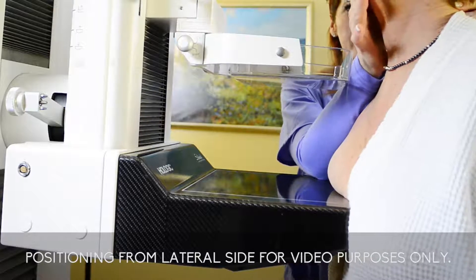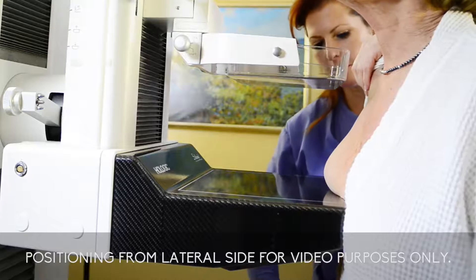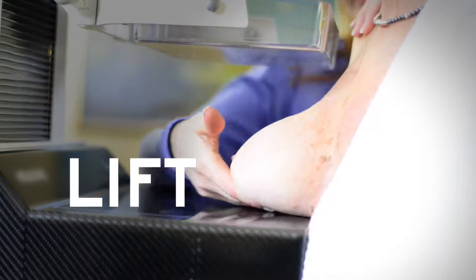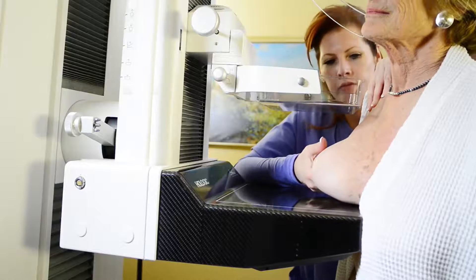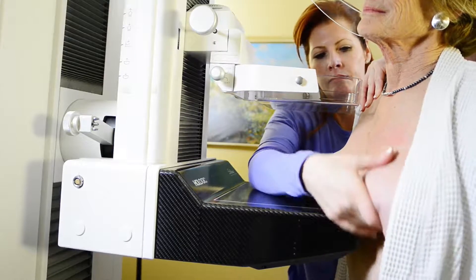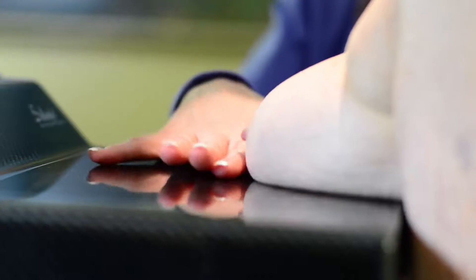As usual, position the patient in front of the machine and adjust her stance for the type of exposure you're taking. Just as always, lift the uncovered breast to elevate the IMF and adjust the height of the detector. Always bring the opposite breast forward onto the bucky, but drape it enough to the side so that there are no folds in the cleavage.